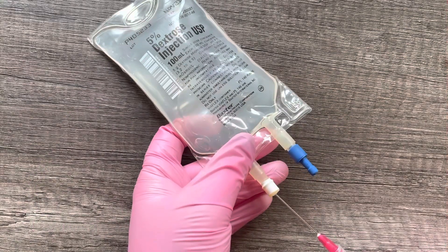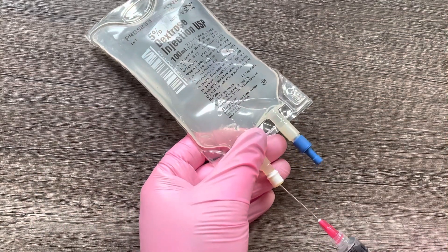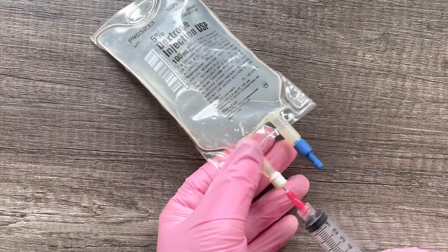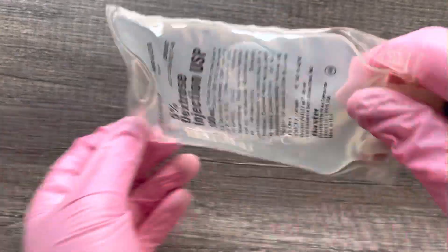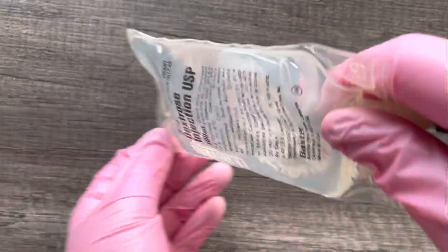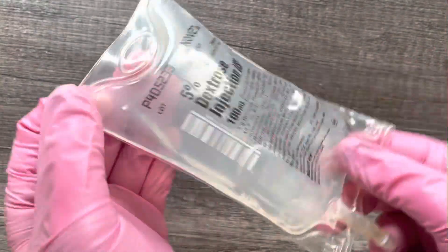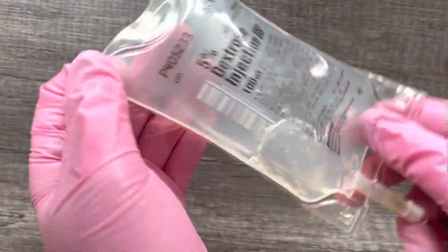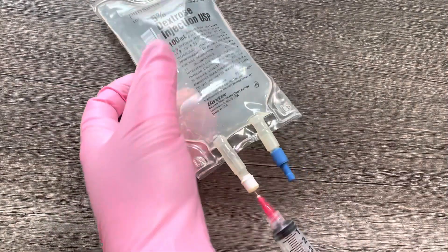I've drawn up my one ml of medication and I'm going to go ahead and put this into the medication port on my IV bag. From here you just want to give it a little bit of a turn — we don't want to shake it to cause any bubbles — just mixing that one milligram into the 100 mls.